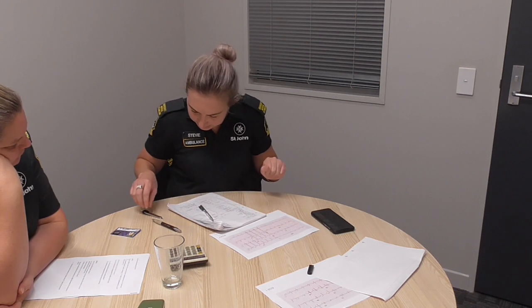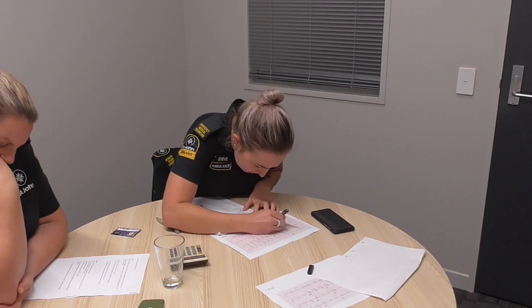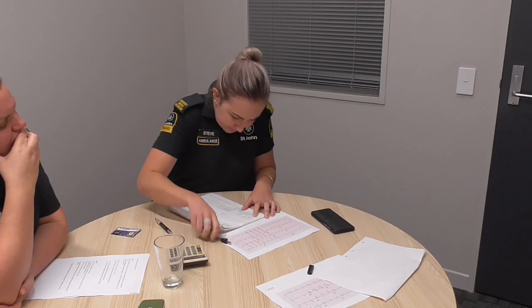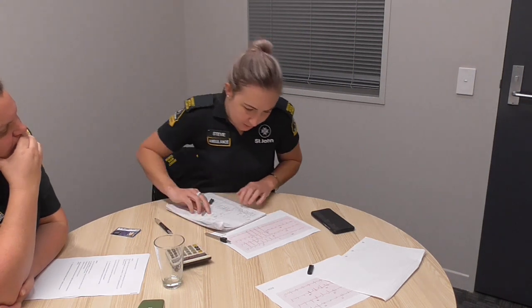The regularity is nice and regular. Therefore, again, we can use the 1500 method.